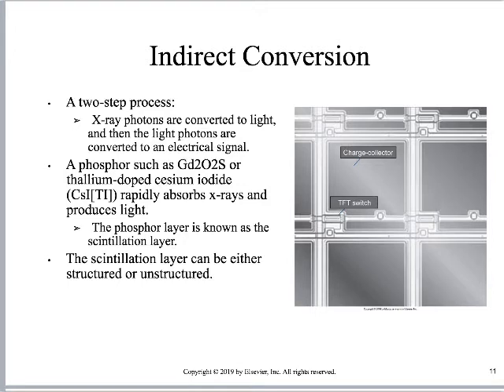Okay, well, we've already indicated what the drawback is. Let's talk about cesium iodide real quick. This is a really beautiful illustration of cesium iodide, right? It's not turbid, it's structured, right? Cesium iodide crystals, they actually look like crystals to me. They've got like these little tunnels to them, right? It's quite beautiful if you look at the illustration on page 68. So when X-rays strike them, the tendency is that the light will be either going down the tube or up the tube. It's not turbid, it's structured. What's the drawback with that? It's fragile. It is a very fragile thing. This is the one you would worry about dropping.